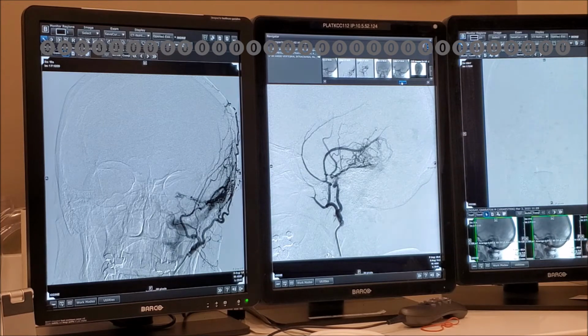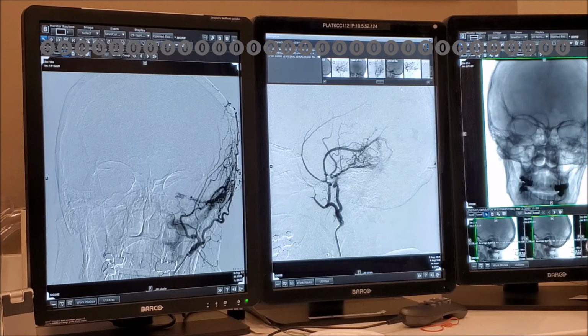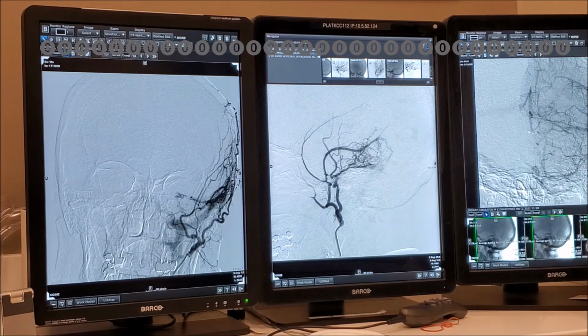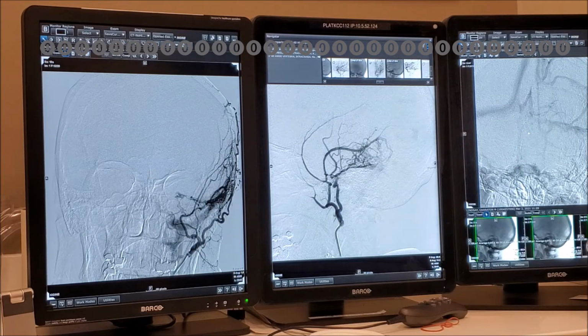Keep coming, keep coming. Bit further. That one there. This one? Yeah. Ah, it didn't work. Okay, so click this one. There you go. So if you run that through, you sort of see it faintly there. It's like a shadow, huh?